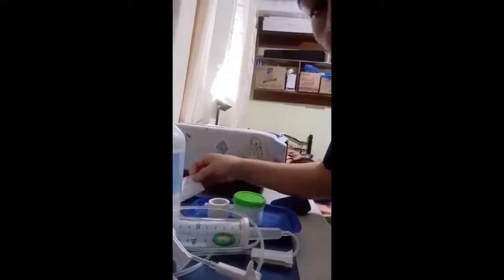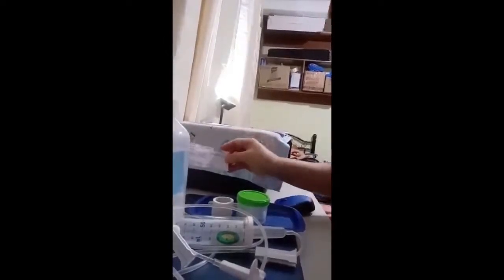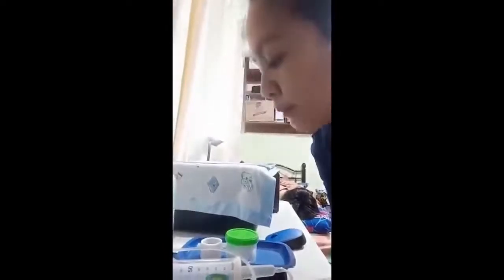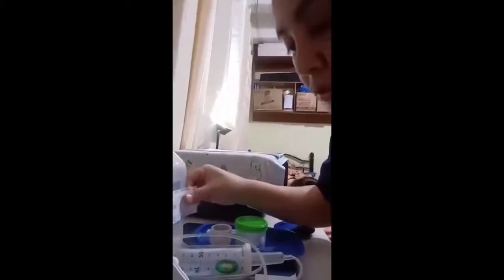And also we have to be sure that we will make an IV card to be attached to the IV after the infusion, so that it would give the nurse on duty the appropriate information regarding the patient's infusion.